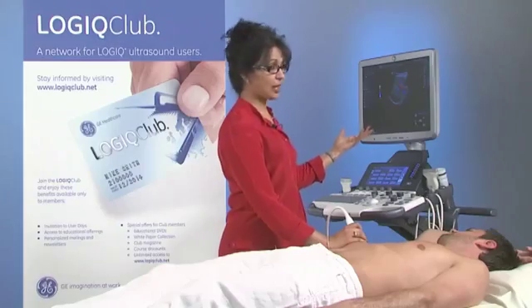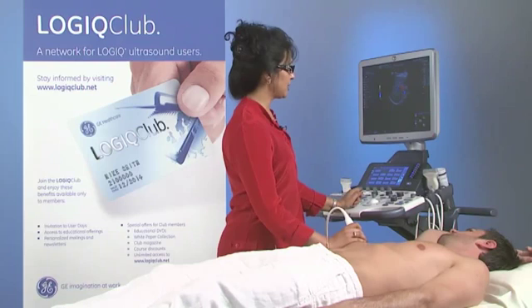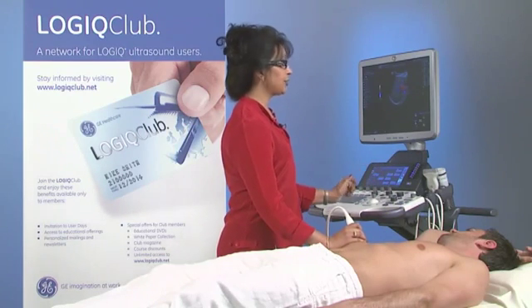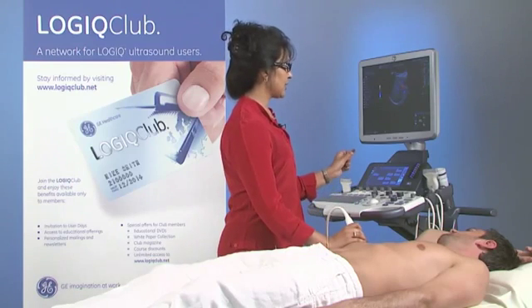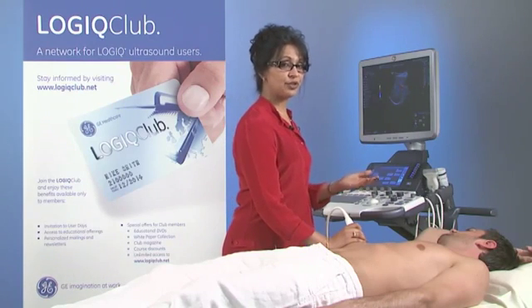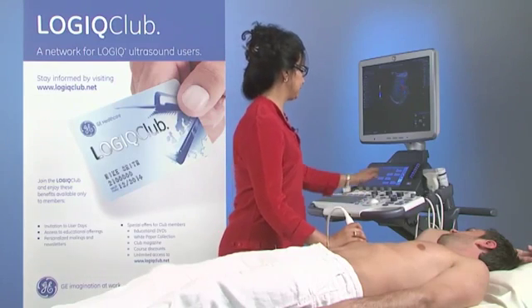So some of the things that you can do to optimize your color. One, to increase your frame rate. Obviously you've seen I've narrowed my color box to pick up my frame rate. The other thing that I can do is on page 2 of my touch panel screen, I have line density. I can also decrease my line density if I want to pick up frame rate. So my line density is my frame rate versus my spatial resolution. So depending on whether I want better temporal resolution or whether I want spatial, I can adjust the parameters accordingly.